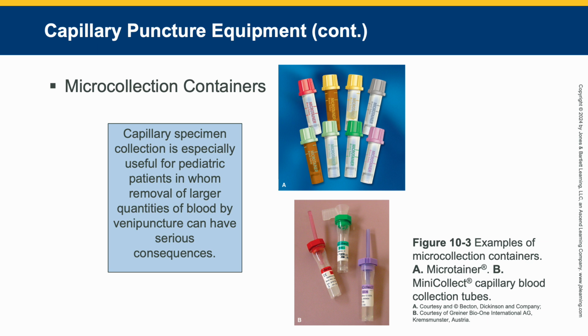If you look at the caution in your book, it's on page 355. This is something that you need to be aware of that sometimes people do. If you collect a very small amount of venous blood by a syringe, like say you're drawing a patient and they are a hard stick and you get just a little bit of blood, but that's it, you don't get much else, so you don't get enough for that big tube.